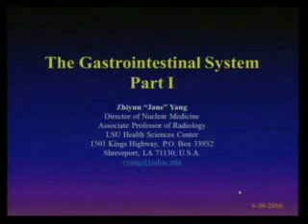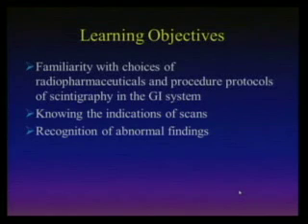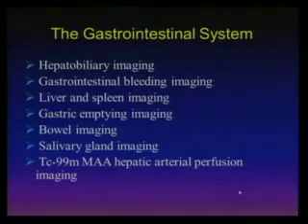And then just for your ear to take something, maybe not only nuclear medicine cases, and then you have to protocol that. So the goal is just the basic knowledge of GI scintigraphy. Objective: know the basic things, radiopharmaceutical, procedure, knowing the indications of the scan, recognize abnormal findings. So this is all included, but don't worry, we only go through the first two today because that's the most ER cases.